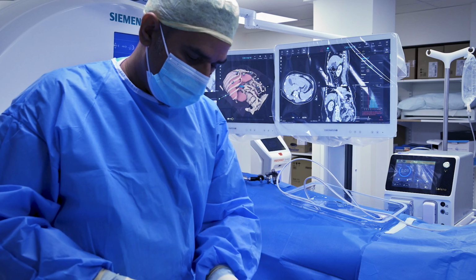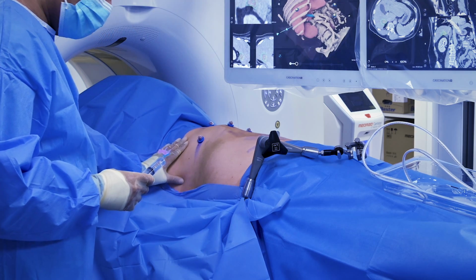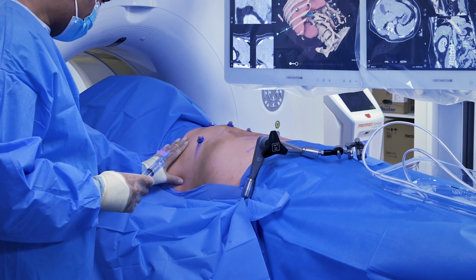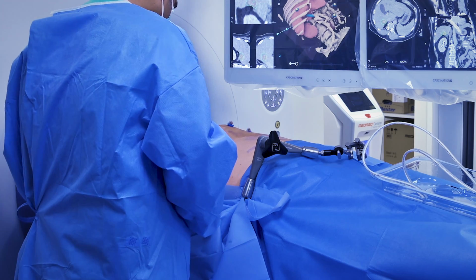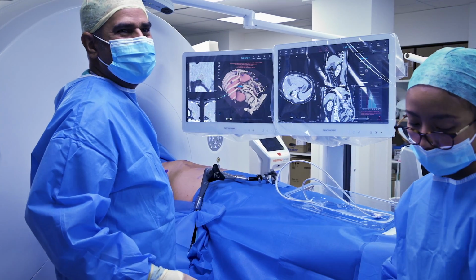It's a bit of local anaesthetic. Should say again that the effectiveness of this whole procedure is such that it's actually hard to see where you've made a mark on the patient, but it's down here. I've actually caused more bleeding through giving the anaesthetic than through the actual procedure itself.